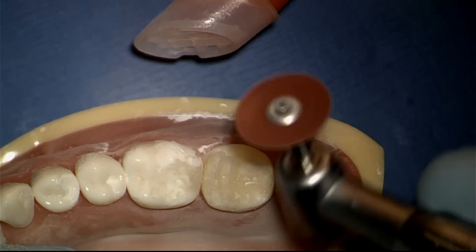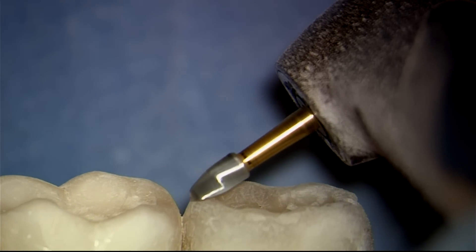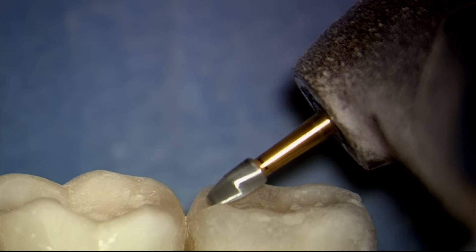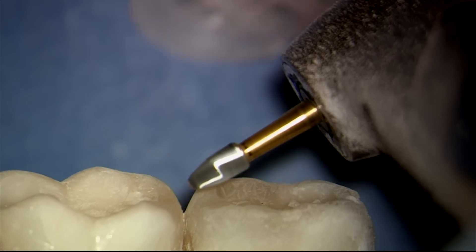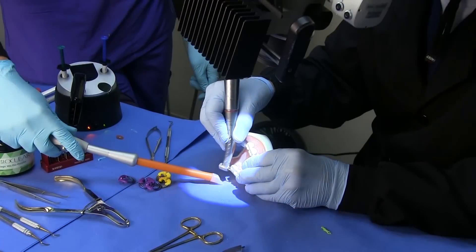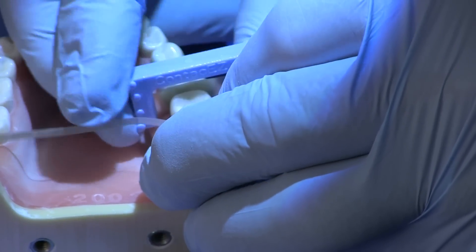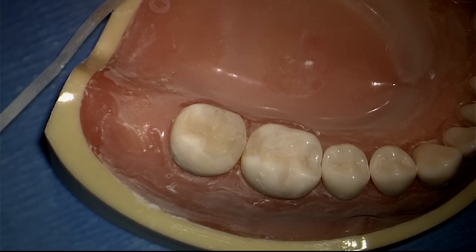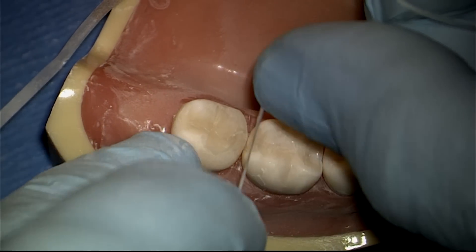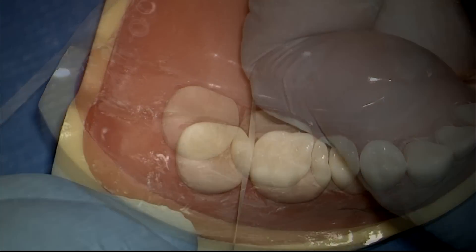Because the twin ring creates 5 pounds of separation and a diamond wedge up to 3 pounds of separation, the net separation pressure is up to 8 pounds. Get ready for tight contacts. In order to get floss and finishing strips through the contact, it is usually necessary to slide the blue true contact polishing saw through the contact and then use wax floss and finally the composite polishing strip.